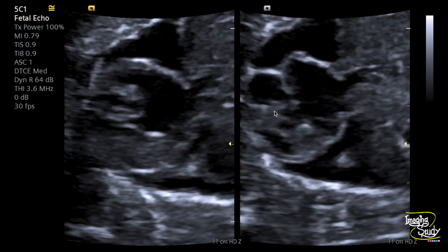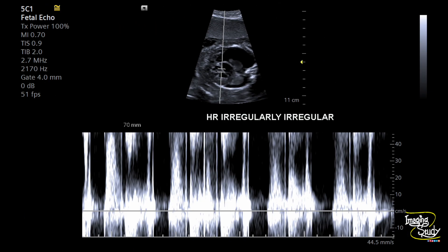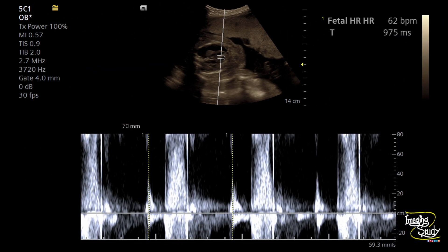You can see the right atrium is dilated and the ventricular walls are also slightly thickened. The heart is enlarged, and you can see the pleural effusion. We measured the heart rate with pulse wave Doppler, and you can see the beats are quite irregular — the rhythm is not maintained, and there should be some tricuspid regurgitation also. At this time of measurement the heart rate was 62 beats per minute, which is very bad in terms of prognosis.